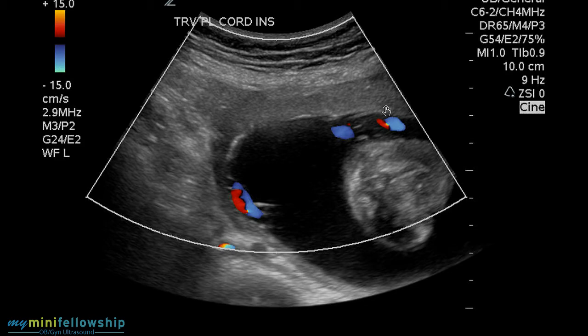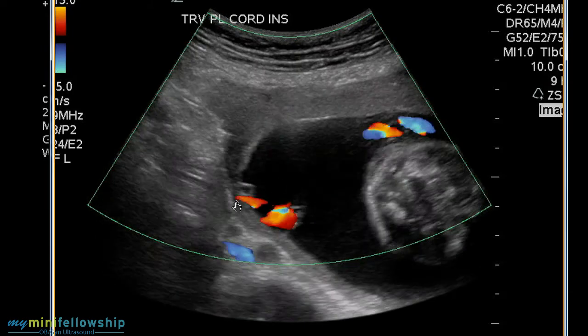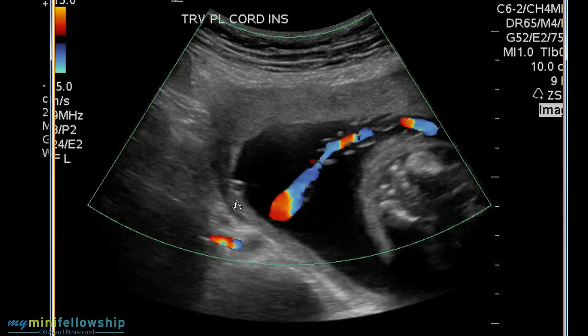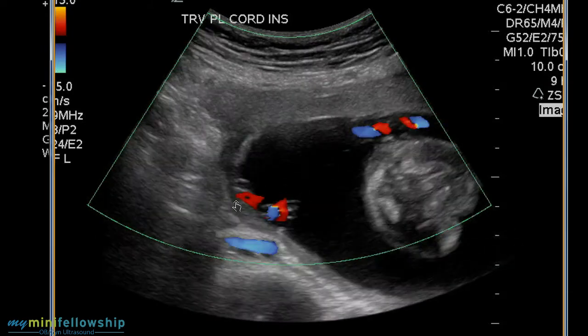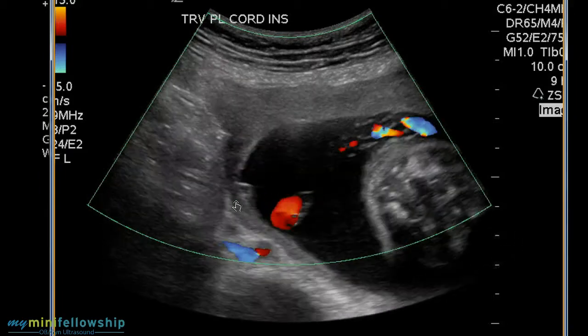So even if this is completely away from the cervix, just in case. Yes, the bottom line is vessels wander. Once they're off the placental surface, they wander. And you want to be as convinced as you can possibly be that it didn't wander over the cervix. There was a cine clip that I thought was helpful. Here you can see very nicely how this is a Velamentous insertion of the cord, which will then subsequently ramify over the placenta.